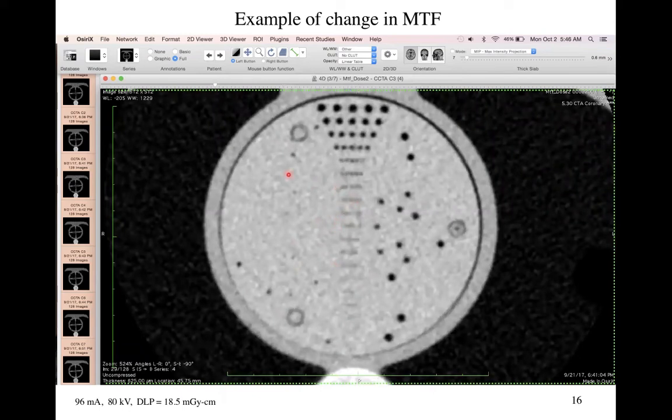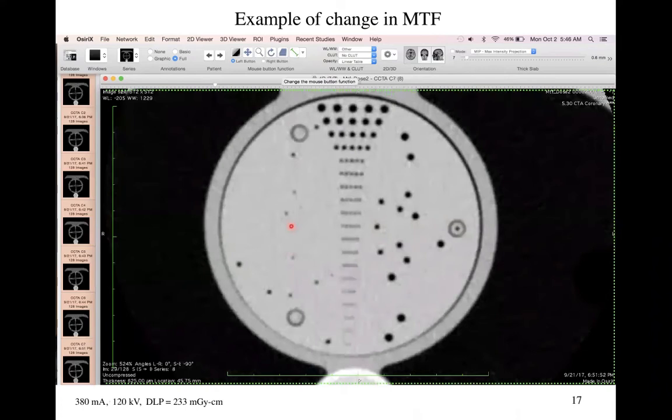And this is the decision of the engineers making the image, right? It's like, how much blurring do you do in order to make the picture have a background that doesn't just look like random numbers, versus losing detail in your picture? A lot of it depends on how much detail you actually need in your picture. And then, of course, there's the choice of just imaging longer, making averages, so that you can have a reasonable looking picture with a low random noise value and not do spatial averaging.